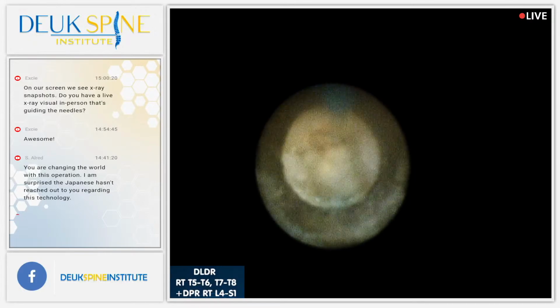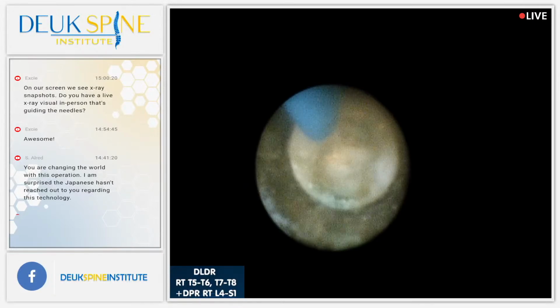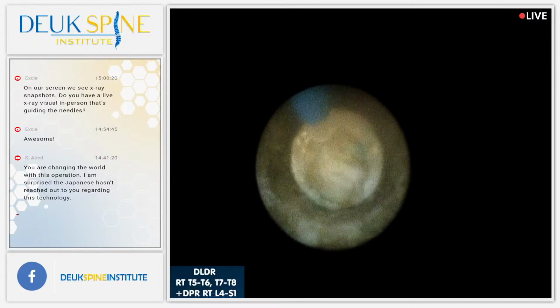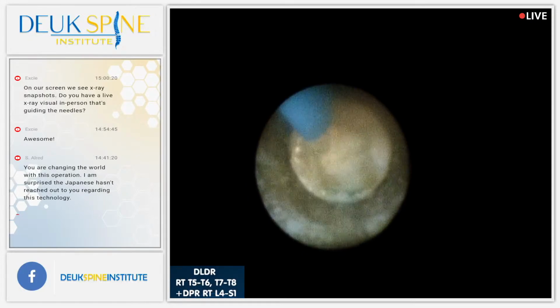By the way, you can see the healthy nucleus down below. We don't talk much about it, but see how white it is? That nucleus down there is pretty darn healthy. It looks good to me. I don't think that's scar tissue. I think it's nucleus. And it's the blue stuff that's degenerated. It's the blue stuff we want to get out. Leave the white stuff alone.